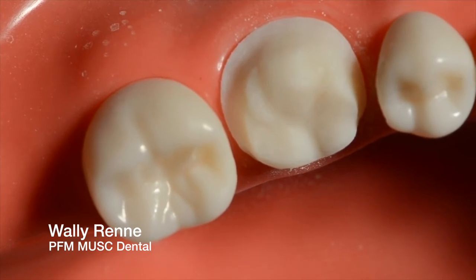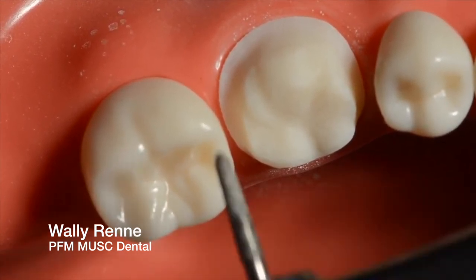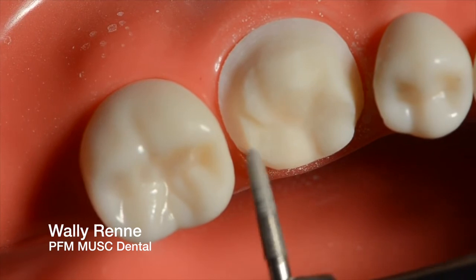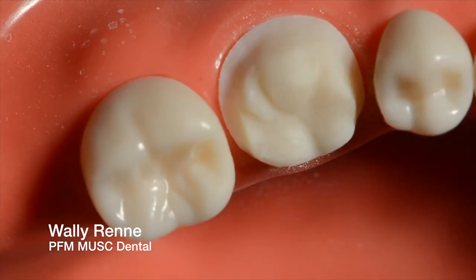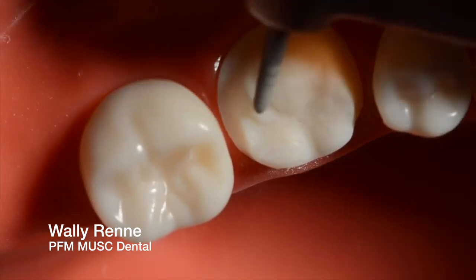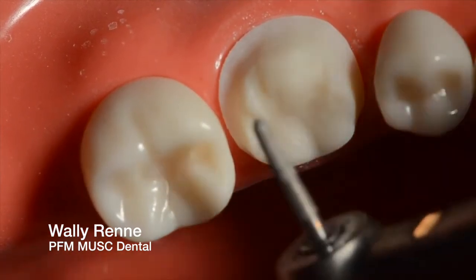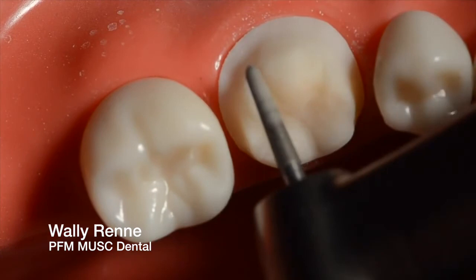Now we're going to smooth some things. You notice the heavy chamfer there and then as you start to go to the lingual, you start to get a lot lighter — although it's hard to see from this angle. That's the 018 still, just smoothing some things. I'm adding a little bit of delineation for that distal buccal cusp at a slower speed. Don't do too much — you don't need crazy anatomy, because sometimes you wind up ruining it when you go back and try to do all this. So you've got to be careful. Make sure to always re-accentuate your functional cusp bevel after you do that.